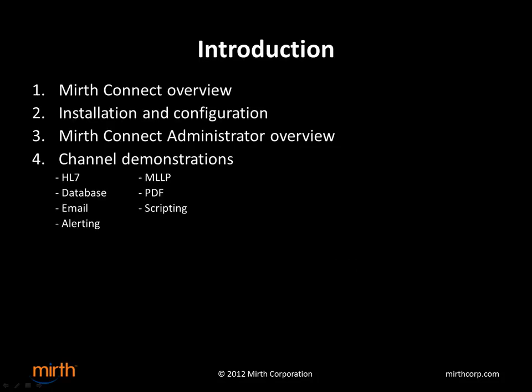First of all, I wanted to give a little introduction about what I'm going to be talking about today. First, I'm going to give a Mirth Connect overview where I'll go through all the different pieces of Mirth Connect, what it is, answer some questions about it. Next, I'm going to give a demonstration showing the installation and configuration of Mirth Connect. This will cover everything from installing Mirth Connect on a new system, running it, configuring a channel, and testing it out. Third, I will give an overview of the Mirth Connect administrator.